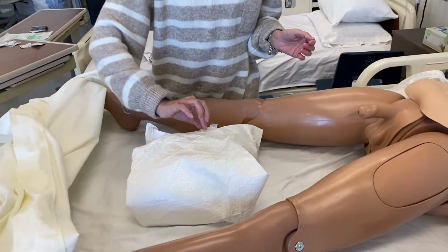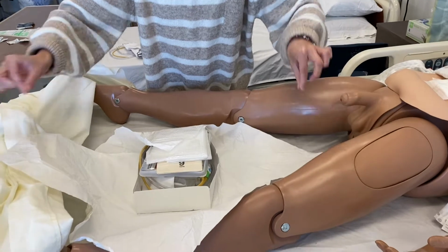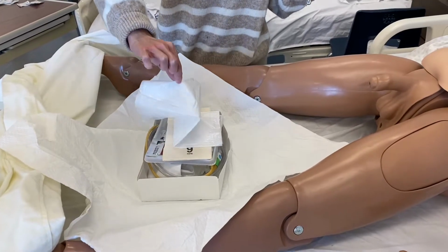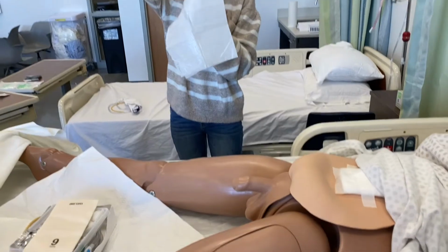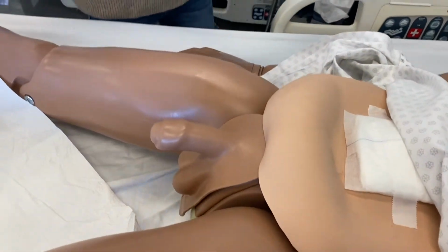I'm going to open this flap away from me. These two out. And then this one this way. Alright. Ground loose. Are you able to help me lift your butt? Can you help lift your butt?